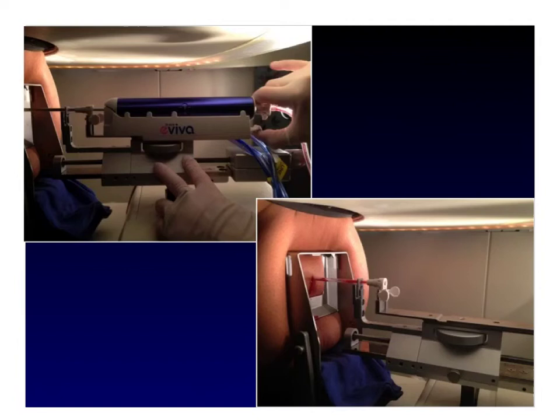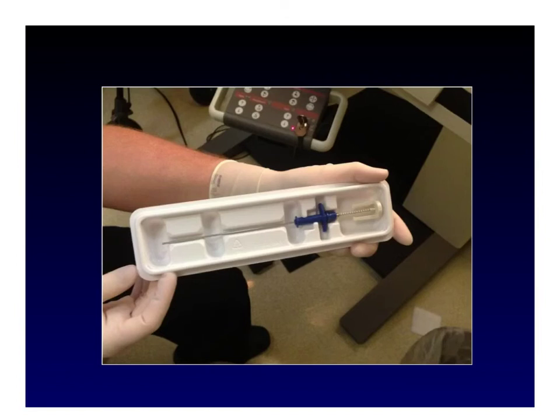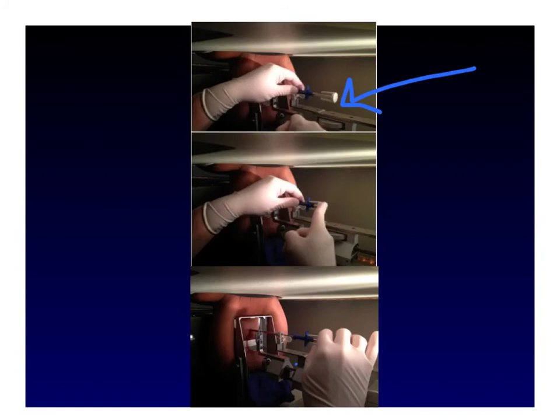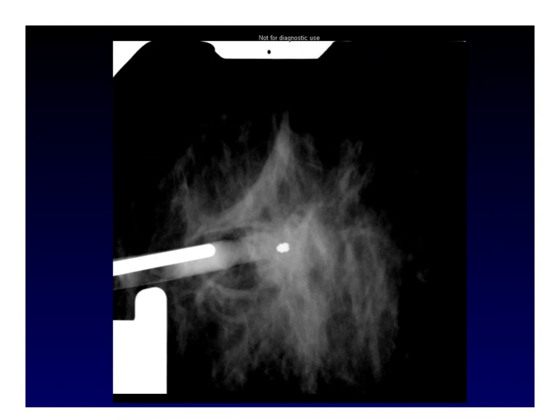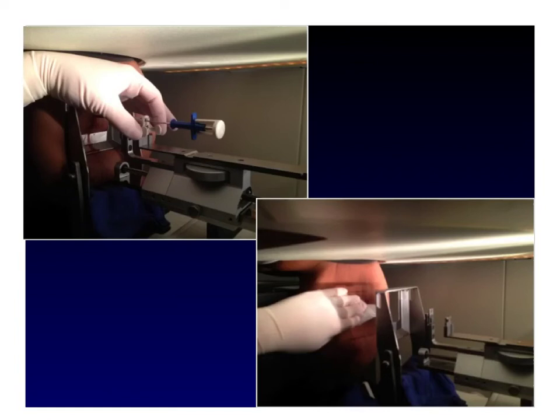As long as calcifications are within the specimen, we're ready to remove the biopsy device. When we remove it, we leave the plastic coaxial sheath in place. We then deploy our clip by placing the clip introducer through the coaxial sheath. To deploy the clip, completely depress the white spring at the back of the clip introducer, then rotate the clip introducer 180 degrees and pull it back slowly. We then take our final post-clip image.